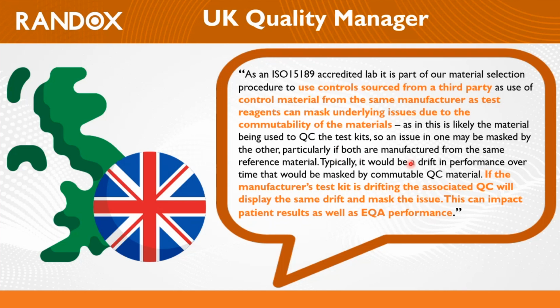Moving on, it also says if the manufacturer's test kit is drifting, the associated QC will then display the same drift. So if the reagent is showing a drift, the QC will show the same drift and mask that issue. This can obviously impact patient results as well as EQA performance for that lab. That's an additional point this quality manager brings in. It's also about the reputation of the lab in EQA schemes, because EQA samples are basically like third-party controls. They can be tested on any analyzer. So, of course, the EQA results also get impacted by this.